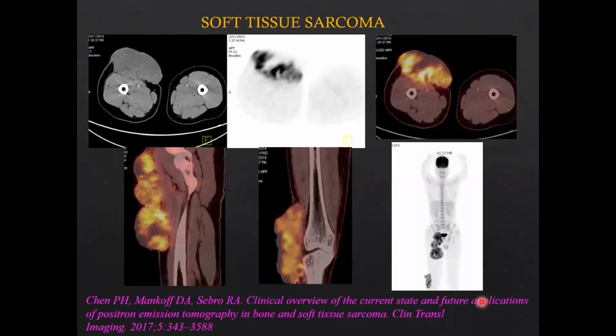Coming to soft tissue sarcoma now. This is another case which is a soft tissue mass having patchy enhancement here. These are the vessels, so it is a post contrast study, and a lot of necrosis is there. Necrosis doesn't give any sort of uptake, except for the uptake significantly seen in the solid viable tissue. If you see this in the sagittal sections, it is a large lobulated cauliflower-like growth with heterogeneous enhancement and inhomogeneous uptake seen involving this.